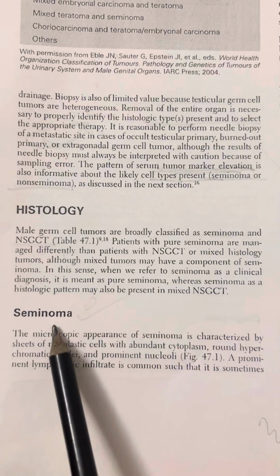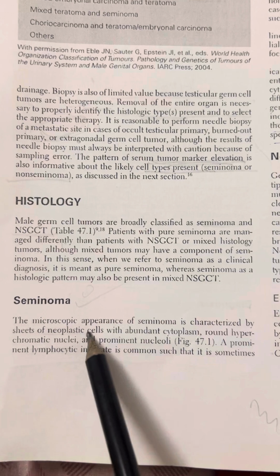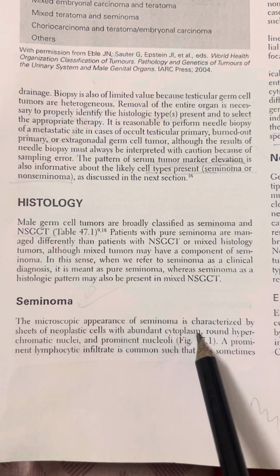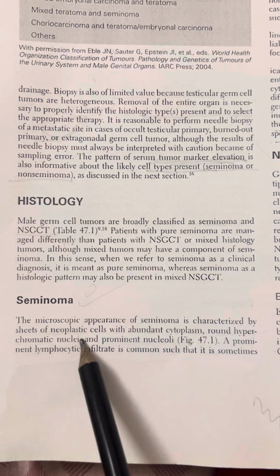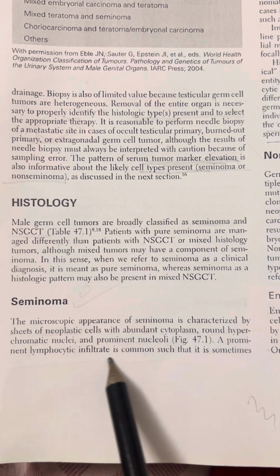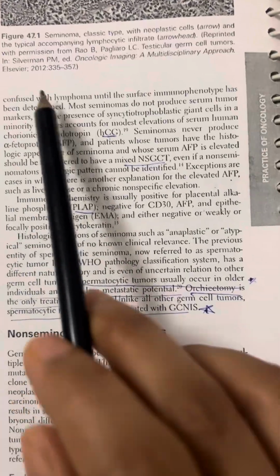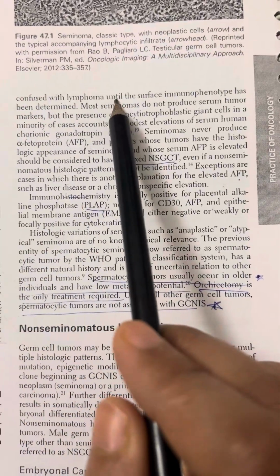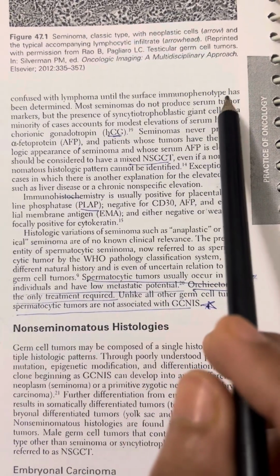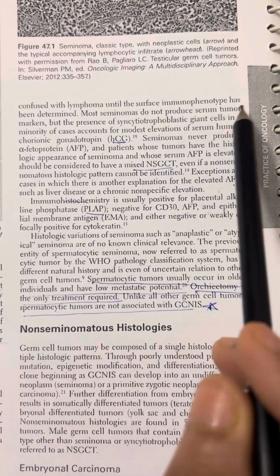Now, seminoma. The microscopic appearance of the seminoma is characterized by sheets of neoplastic cells with abundant cytoplasm, round hyperchromatic nuclei and prominent nucleoli. A prominent lymphocytic infiltrate is common, such that it is sometimes confused with lymphoma until the surface immunophenotype has been determined.